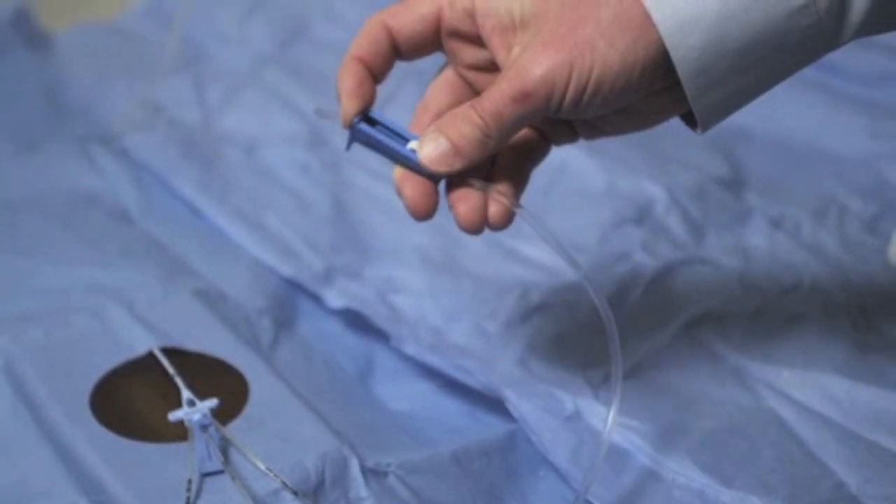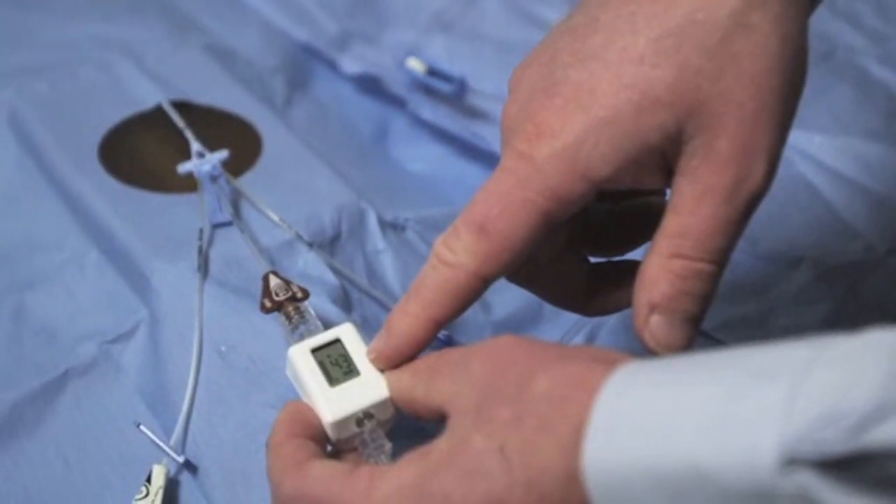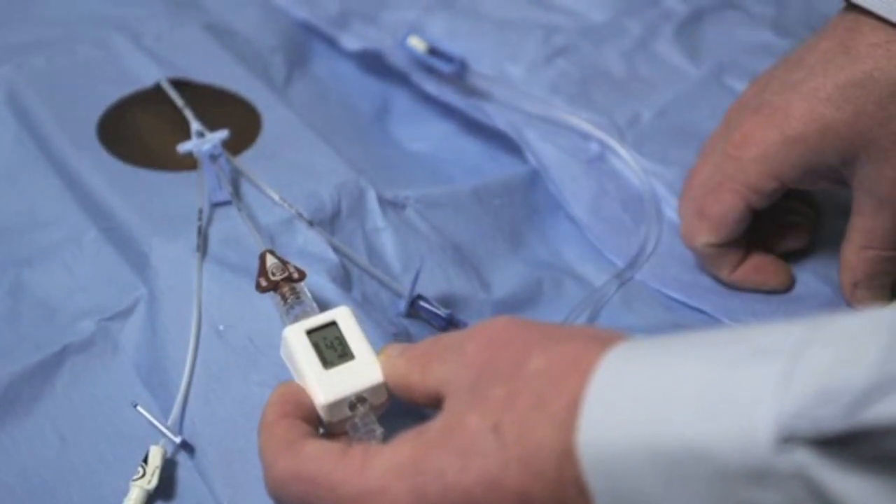Important to note here is that during the infusion of the fluid, the Compass pressure will reflect the pressure of the fluid being infused rather than the patient's central venous pressure.